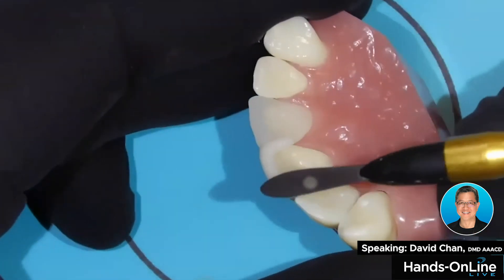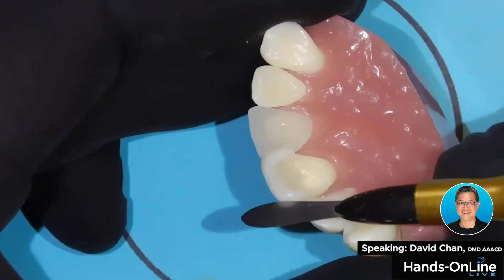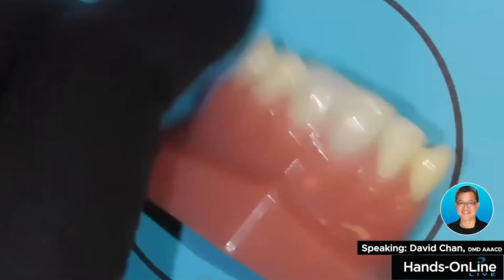And I can use this instrument to take the excess away, because the incisal edge is already established.